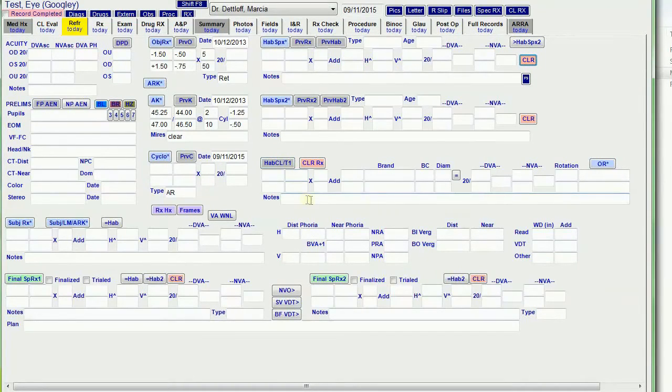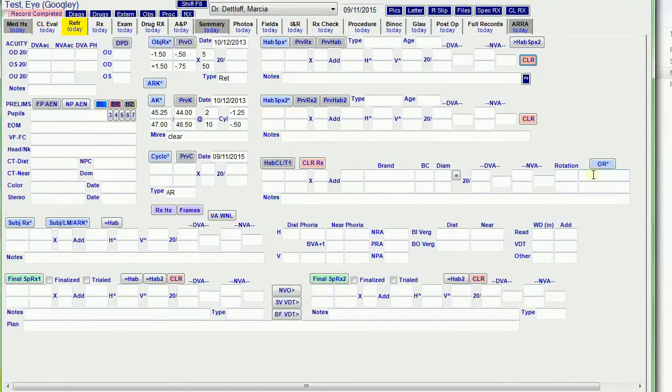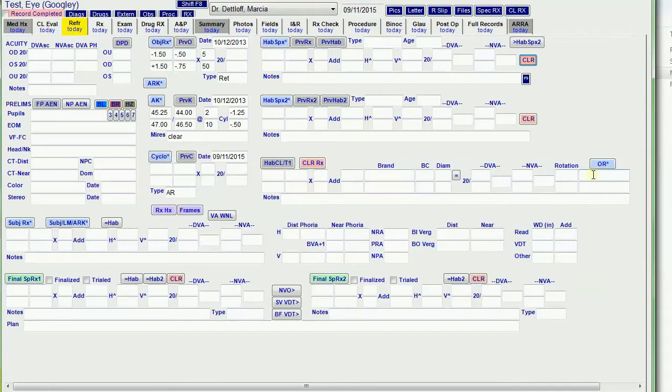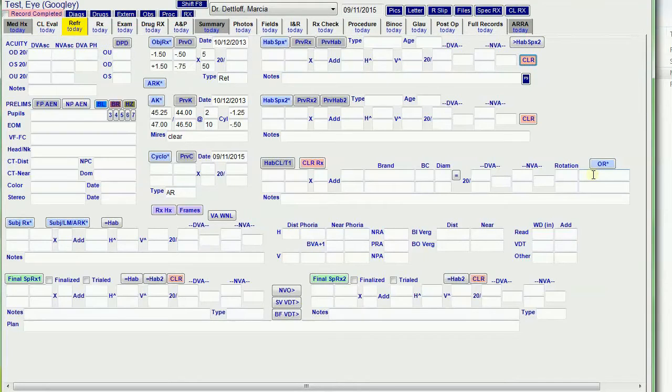Make notes of the fit and the rotation over refraction if I want to. And this over refraction button pulls the AR reading into these fields as an over refraction, and I put AR there so that I know that that's an AR over refraction versus a manual phoropter over refraction.